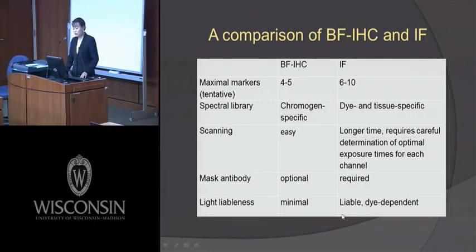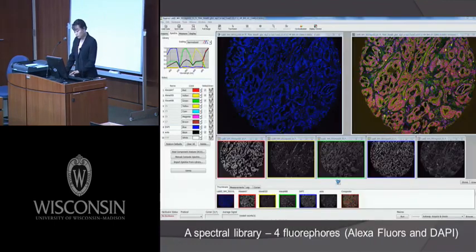Also, another difference between these two assays is that fluorescent dyes are mostly photosensitive, so you have to choose a fluorophore that's relatively resistant to light. In general, there are pros and cons for each assay, so you have to take all things into consideration and decide which assay to do.